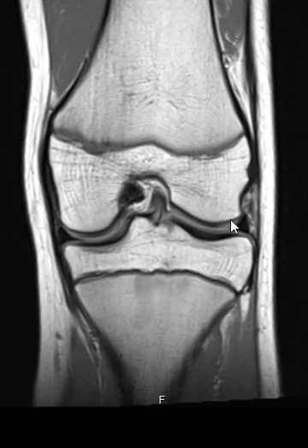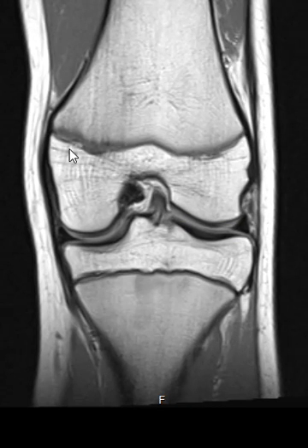Luckily the menisci look normal, the ligaments were intact, no tendon abnormality, all the muscles look great. And if we look here, we can see a transverse band going across — this is the growth plate of the femur. It looks completely normal.